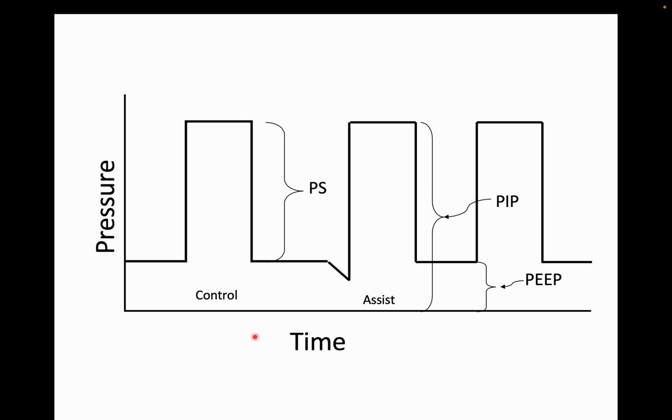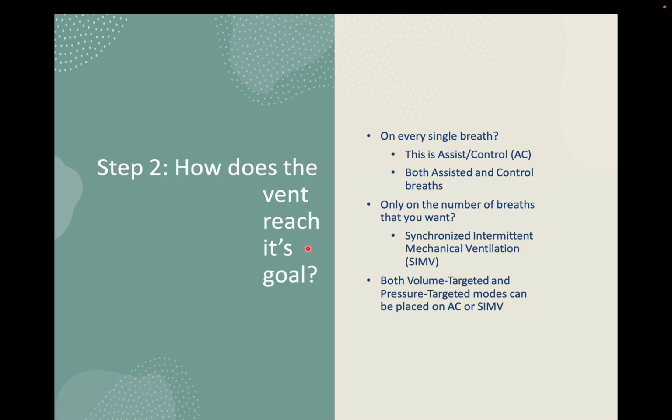This is the principle behind BiPAP mainly, in non-invasive ventilation. We generate inspiratory pressure and expiratory pressure, and the difference is pressure support. This is useful in COPD patients and OSA patients, where we want to oxygenate them better and wash out the CO2 better.